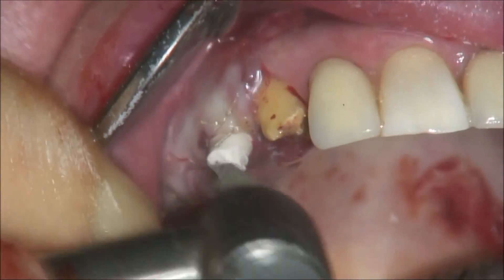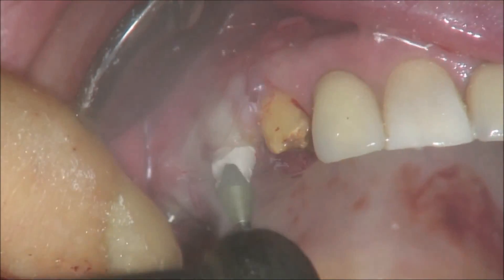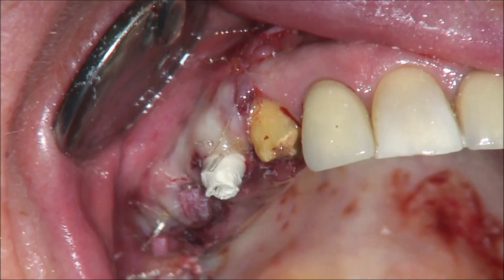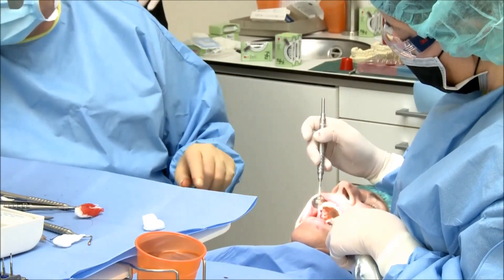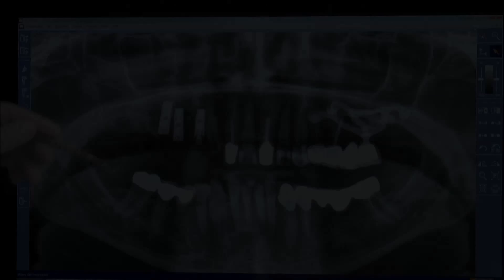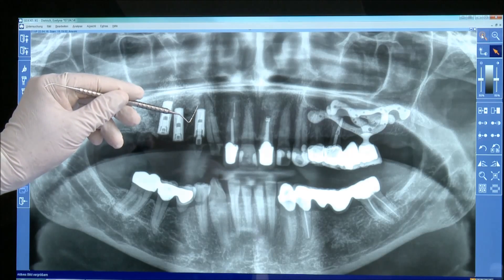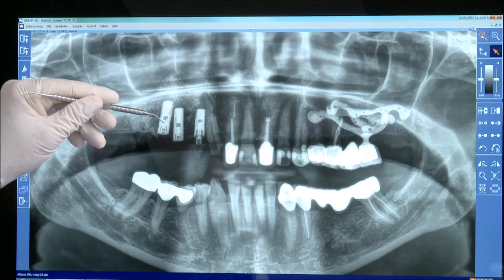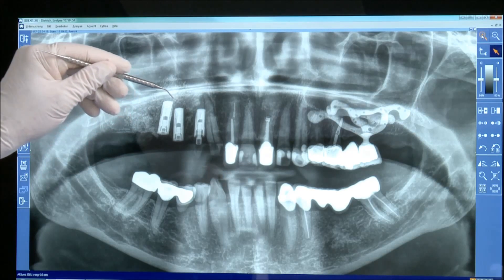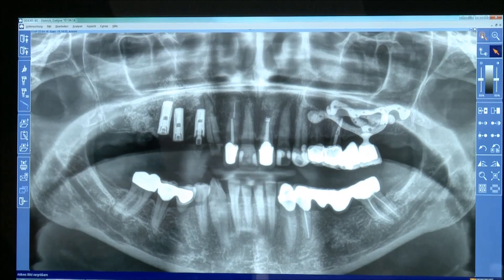We start the suture from the mesial area — a continuous mattress suture. After closing the flap, we prepare the peak abutment with a rough diamond to achieve parallelism between the implant and the natural tooth for a temporary bridge. As planned, we inserted three implants from BHI — one in the first premolar area, one in the second premolar area, and one in the first molar area — along with a large augmentation and sinus elevation procedure. We wait about 5 months to restore.